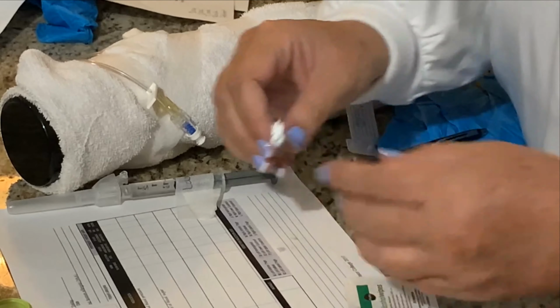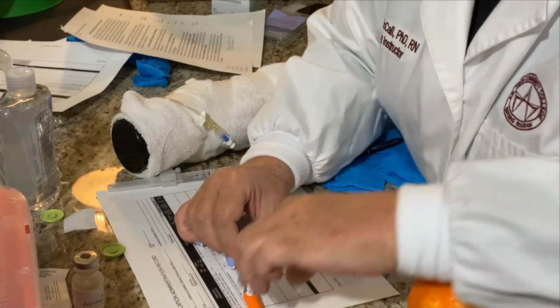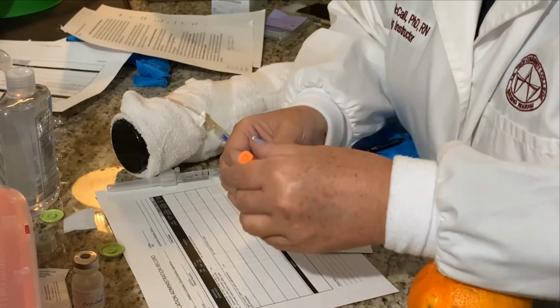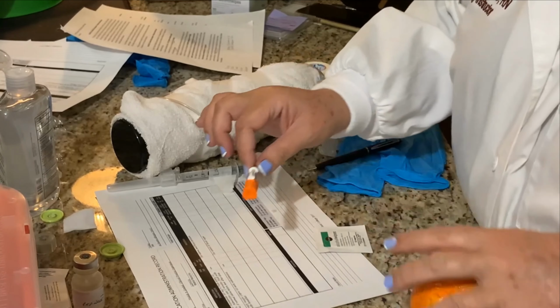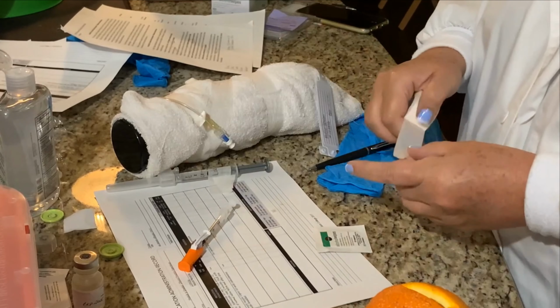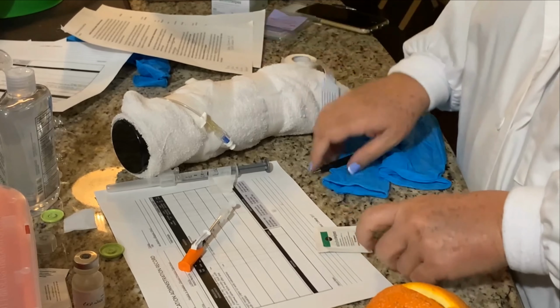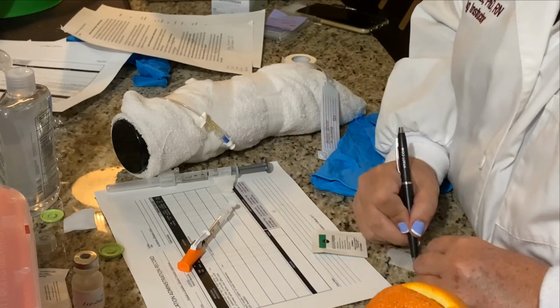Then once I finish, I'm going to do the one-hand scoop. Insulin syringe is a little difficult with that. You don't want to push it too tight, it will bend your needle, so just as long as it's covered. So now again, I'm going to label my syringe. Now I'm giving Lispro. I've done my second check, 10 units.